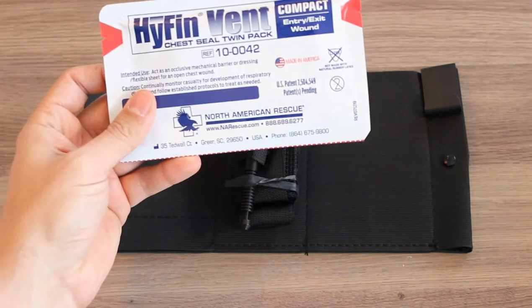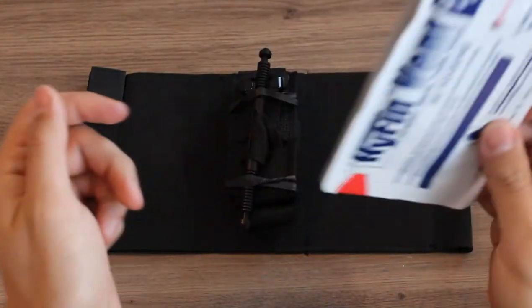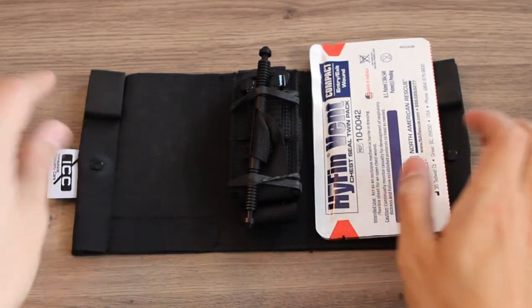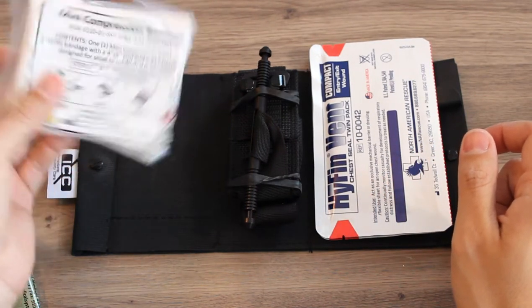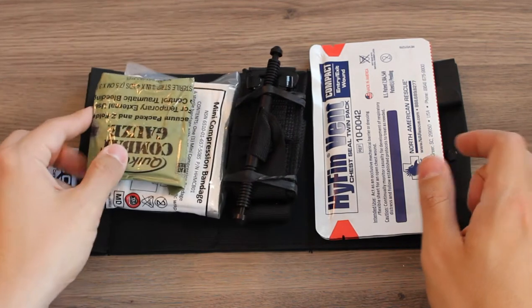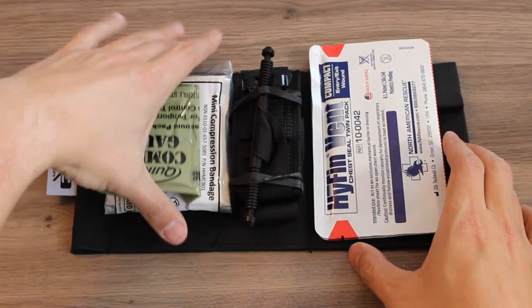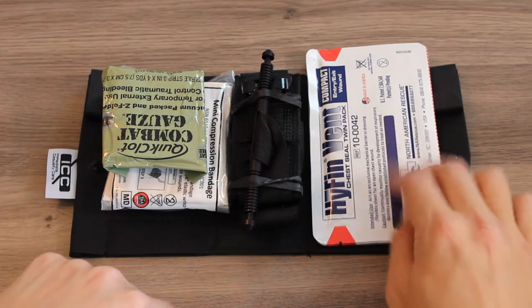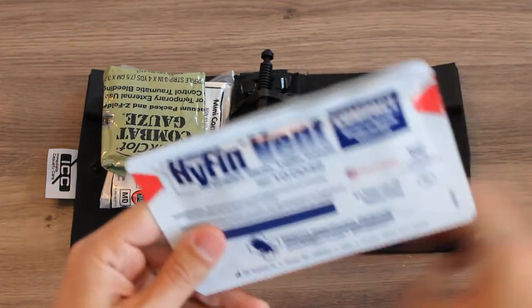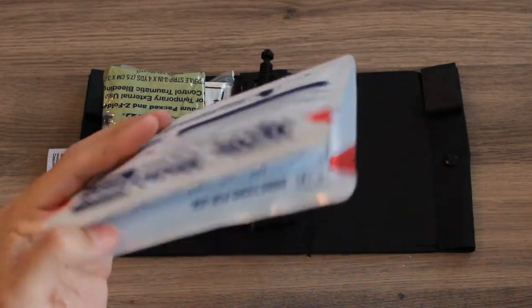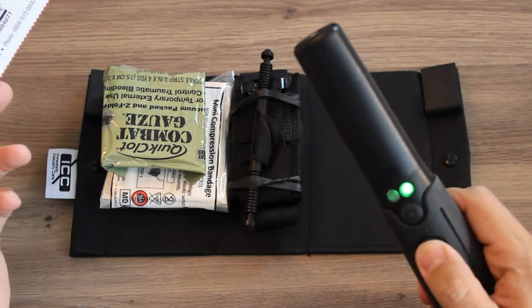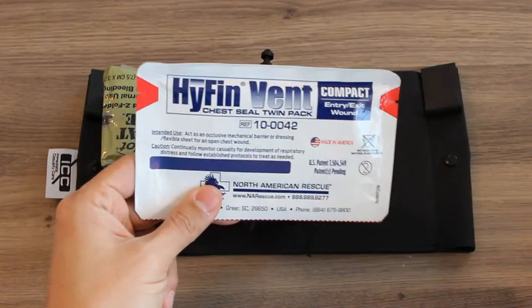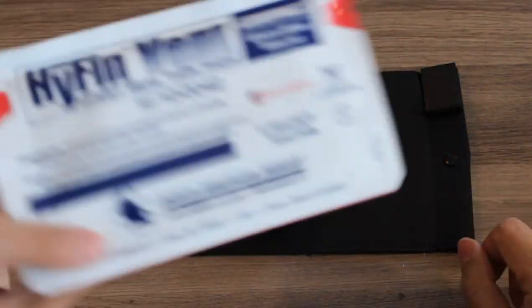We can put Hyphen vent seals—two is one, one is none—in this compartment. Then you can put something like the H&H Mini Compress Bandage as well as some combat gauze in this compartment. I'll show you this system with the items in it here in a bit. But chest seals like the Hyphen as well as the Halo have a metal signature to them. They're lined with a foil-type packaging on the inside, so when you have the metal detector it will set off the wand.